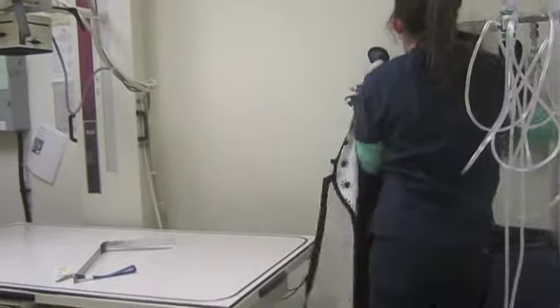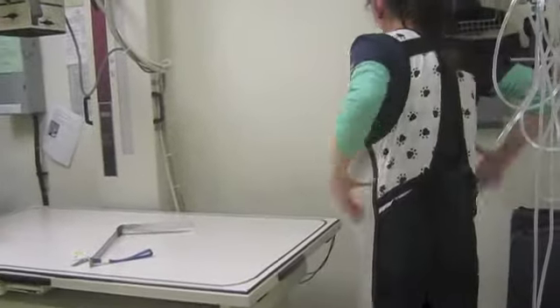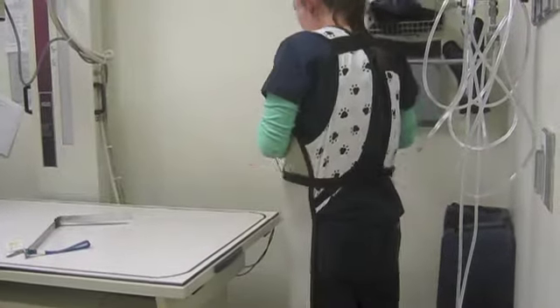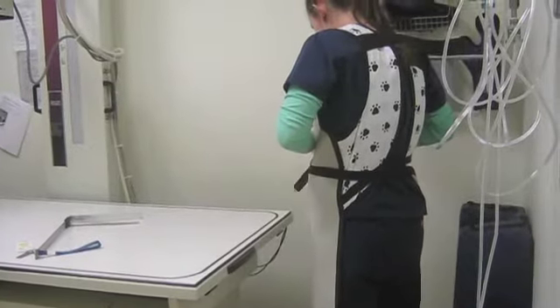Optimally, the patient should be fasted before the contrast study. Any feces or ingesta left in the intestines or colon could create a confusing artifact for the veterinarian. In addition to fasting the patient and administering a cleansing enema, it may be necessary to administer an oral stool softener or mineral oil.